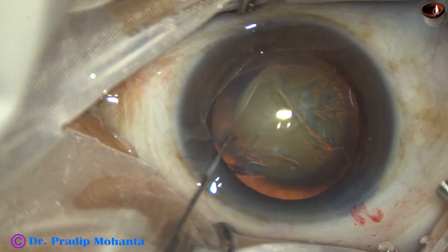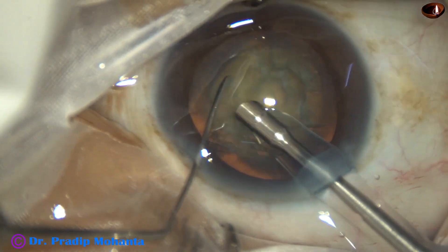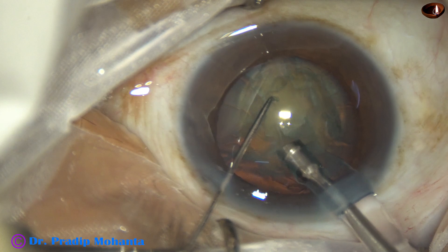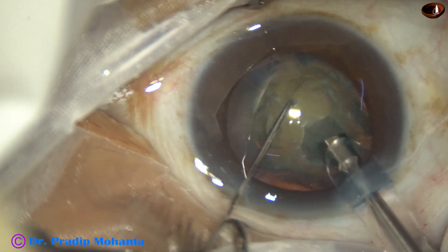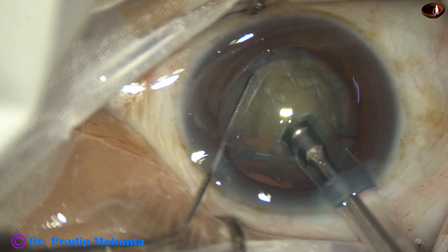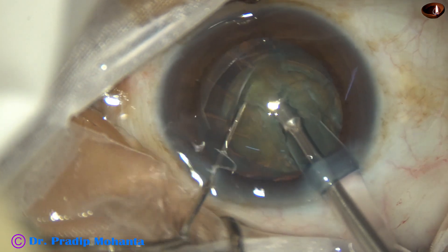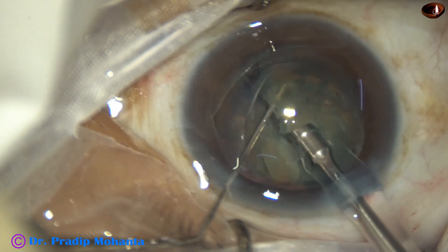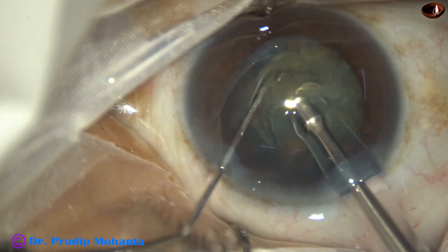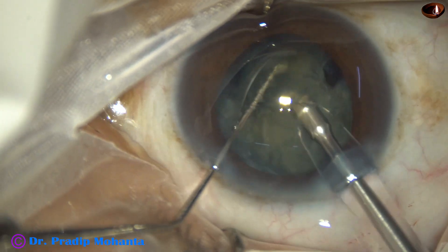I thought this may be an easier technique to learn direct chop. This is a modification of the submarine chop technique. This is the pit — just make a pit, go to the floor of the pit, go for a distance through the substance of the nucleus, and then chop. Since the tip is nicely occluded within the substance of the nucleus, the hold is very good and chopping is also nice.